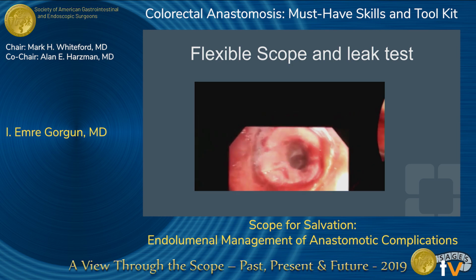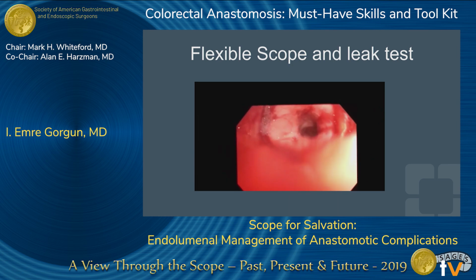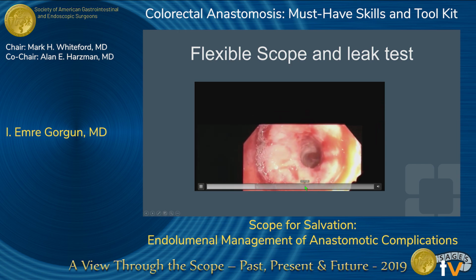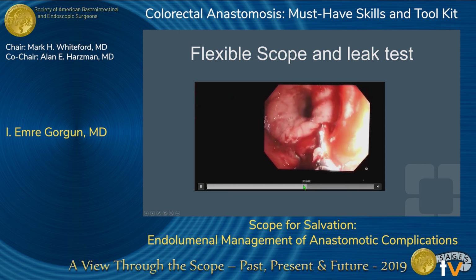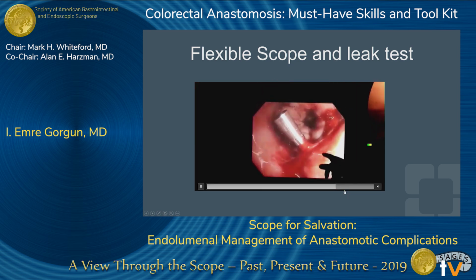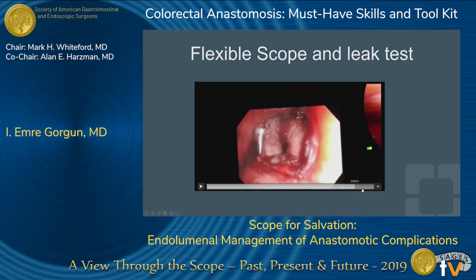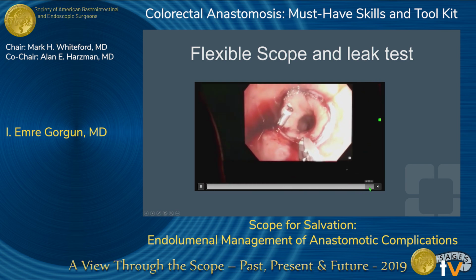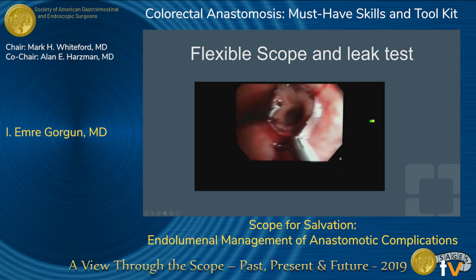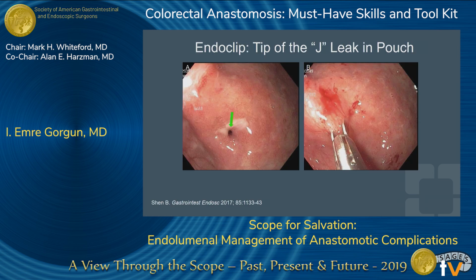If you ignore this, the patient is going to be taken back at night or in the morning. Just fast forwarding, just for the sake of time here, we're a little bit behind. You can put one or even bring a second one in. And you really get that good tissue bite and get that under control. You can do these for bleedings, but also for leaks.